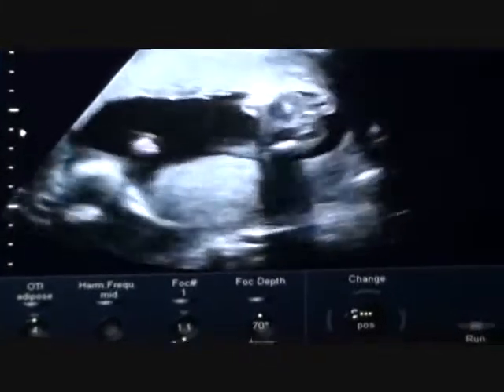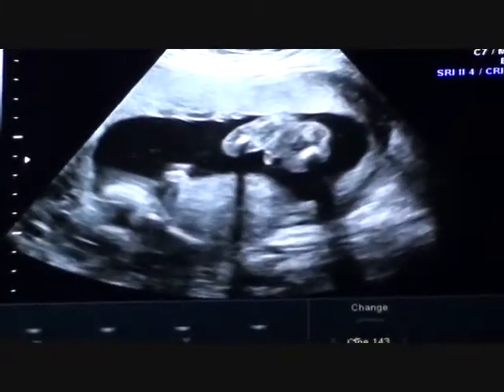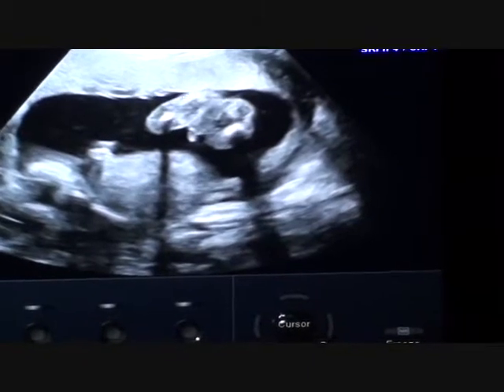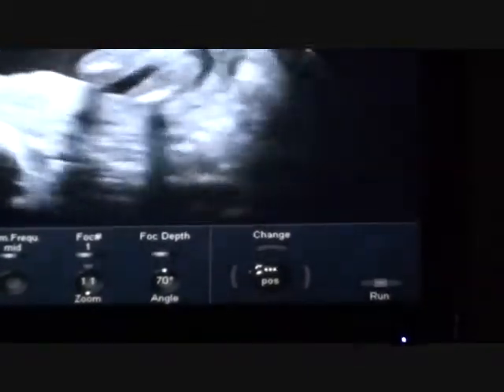All right, what you can already see up here between our legs — I already saw our boy parts. Is there a recording going? This is a little boy part spoken out already, right there. A little bottom up in the air. He's not shy. He wants you all to know he didn't change, nothing fell off.